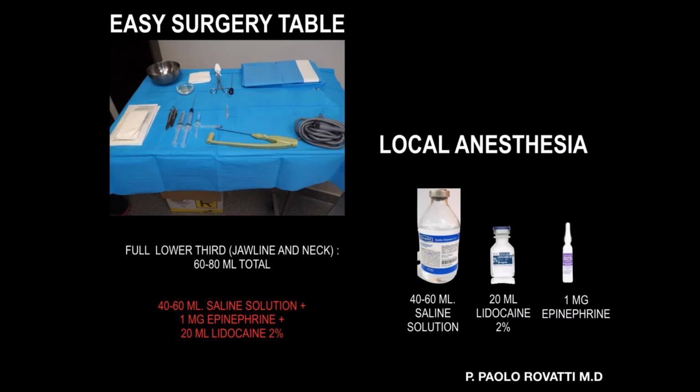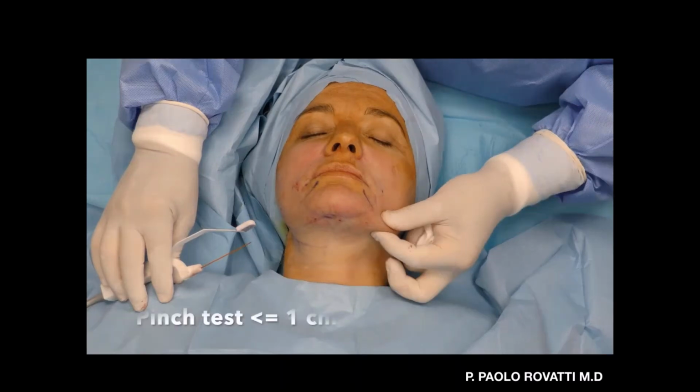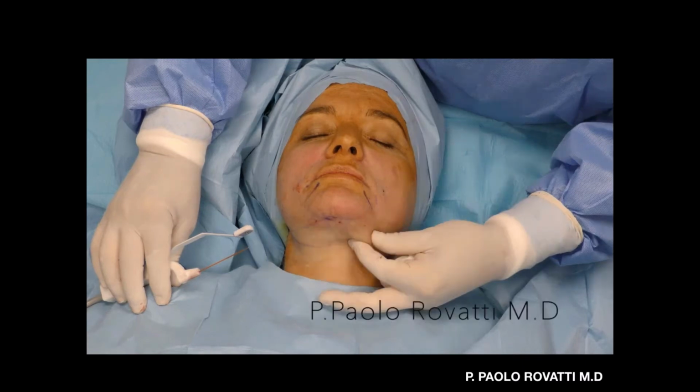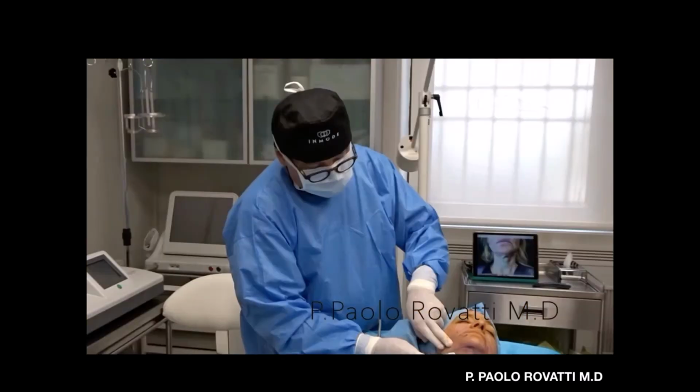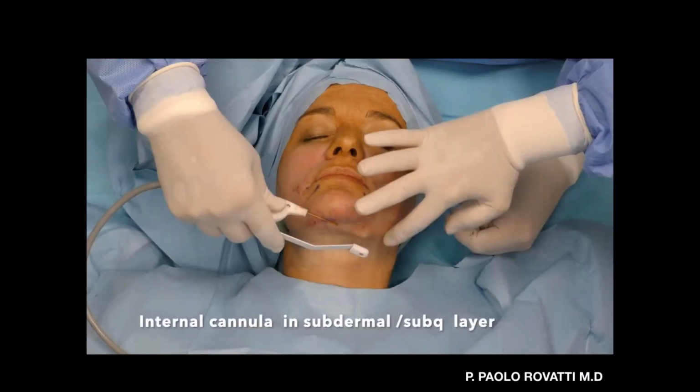Now, this is what I do usually. Well, this is the pinch test. I think it's better to do it before starting, but this is just to show it to you. I'm doing a pinch test, and you see that this woman doesn't have so much fat, and I'm treating this area now, the neck. You can see that I'm in the office, not in the hospital, in the clinic. And look, this is a really superficial treatment. I inserted my probe in the subdermal or superficial subcutaneous layer.